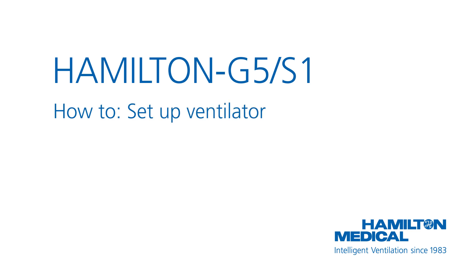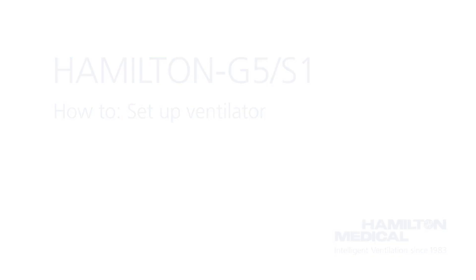This how-to video will show you how to prepare the Hamilton S1 ventilator. However, the procedure is exactly the same for a Hamilton G5 ventilator.